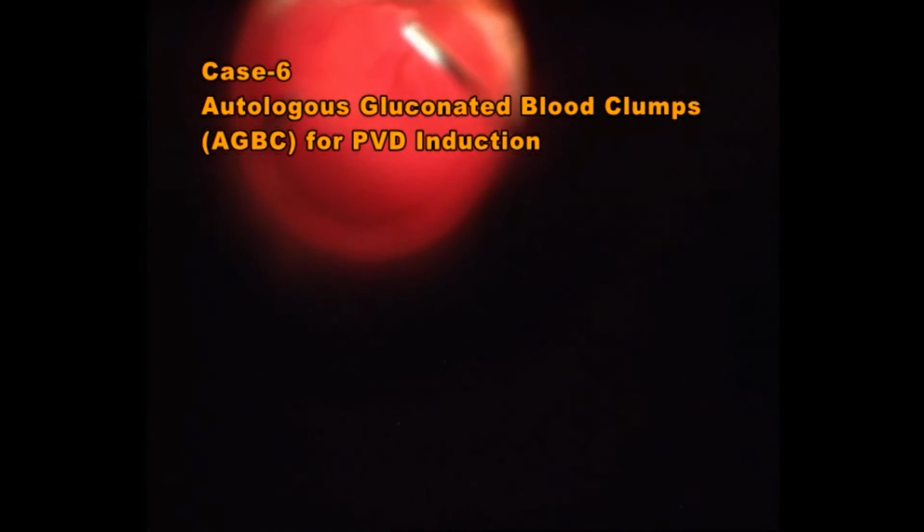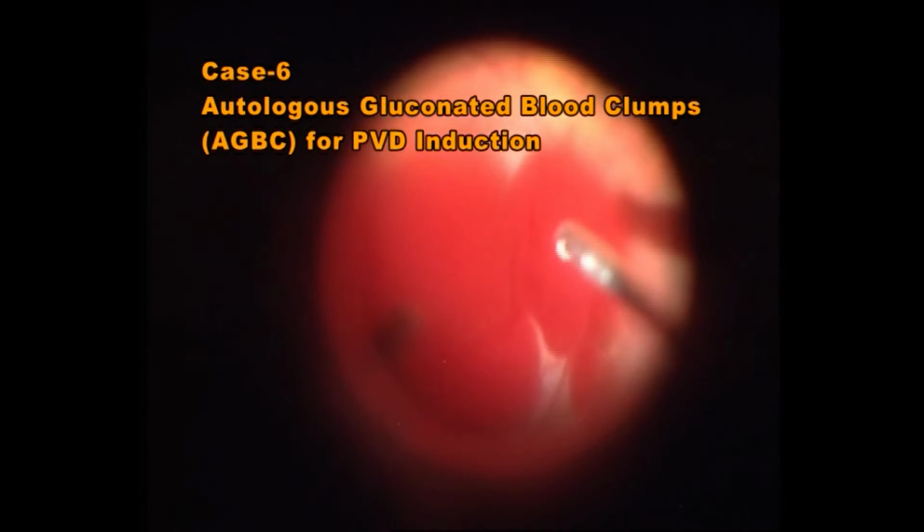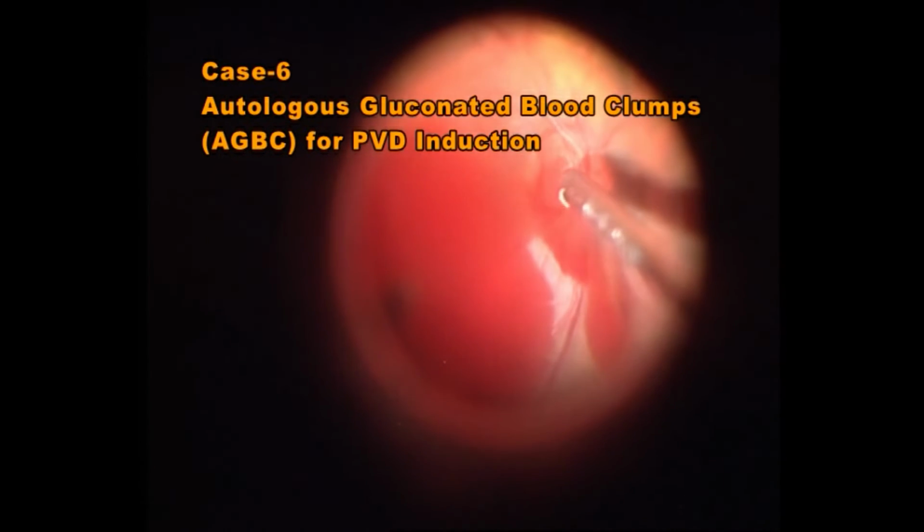The last clip in this series of cases demonstrates the use of autologous gluconated blood clumps for PVD induction. As with triamcinolone acetonide, autologous gluconated blood clumps will also coat the posterior hyaloid face, making delineation of the PHF easier.